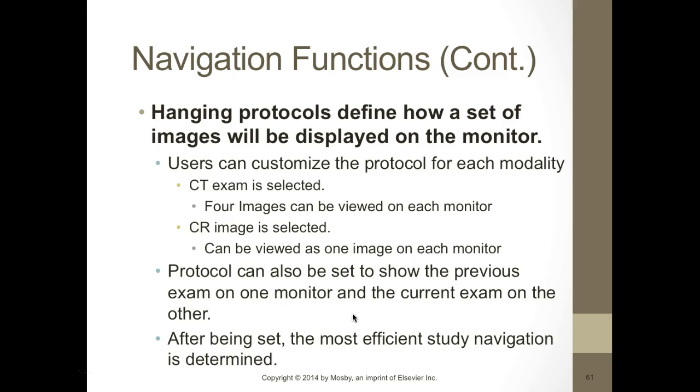After being set, the most efficient study navigation is determined. Each doctor, when they log into the computer, has a hanging protocol. So it's important that they log in and that they set their hanging protocol. That way it's set for the way they like to view the images.